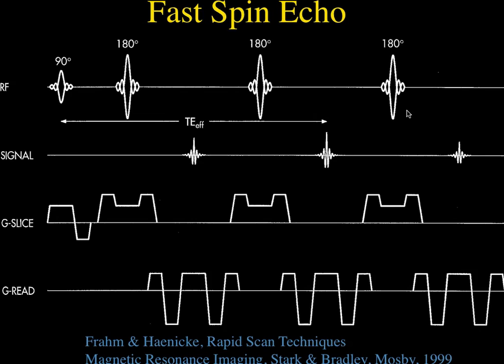So it's still one phase encoding step. Both echoes have the same phase encoding, and therefore you're filling the same line of k-space with each of the echoes. So you end up with two different images, but of the same body part. You run your phase encoding, and then you do two more echoes, and it takes those two echoes and puts them in the same line of k-space. That's right. So it's the same slice, so you just get two images with different contrast.